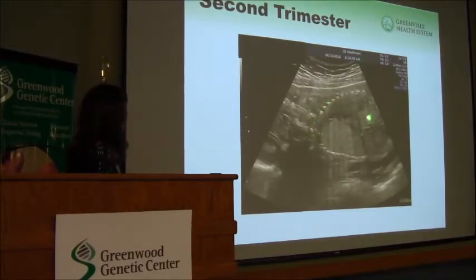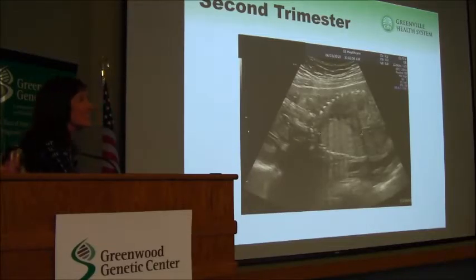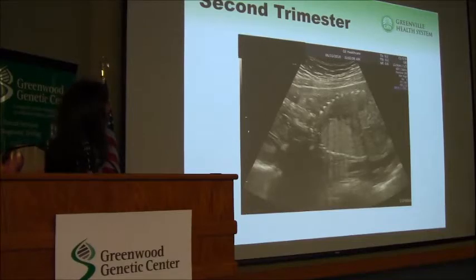This is one we hadn't talked about yet. It's in the chest. Diaphragmatic hernia. Oh, that's coming. Okay. So this is a cystic adenomatoid airway malformation. They appear as sort of an echodense area. Sometimes they can have more cystic appearance, but they frequently will shift the heart towards the right in the chest. We follow these. Many of them have significant issues with hydrops and things that become more apparent later.